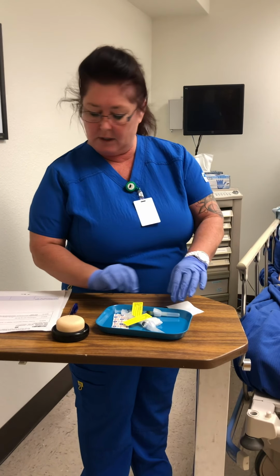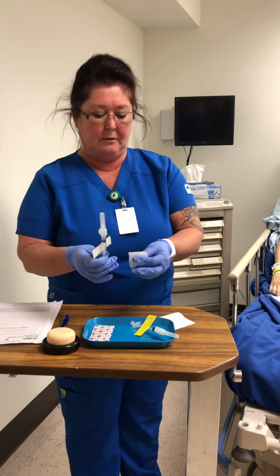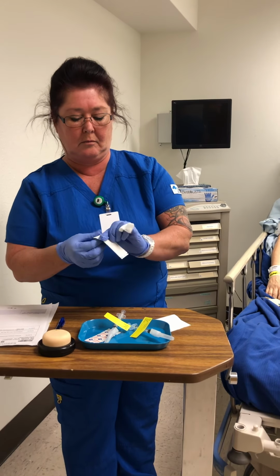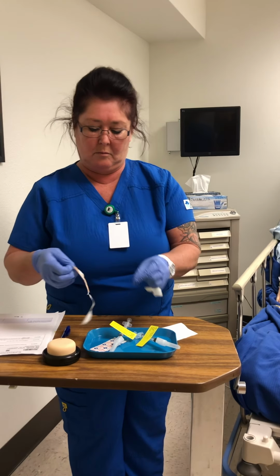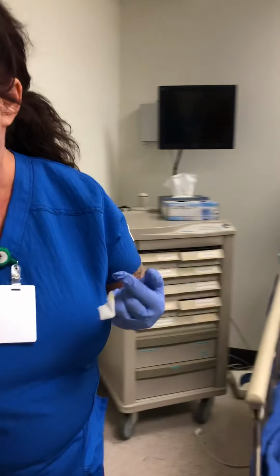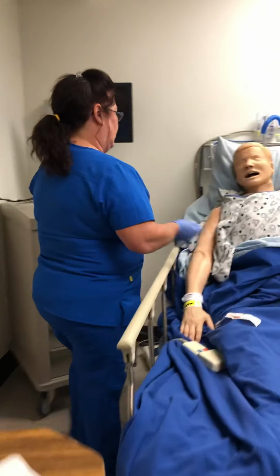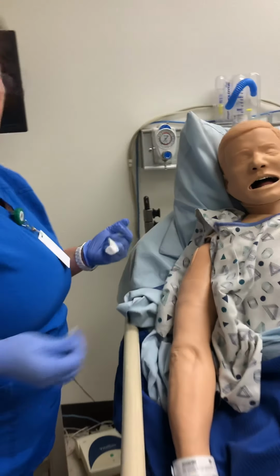So now we're going to do the Phenergan, and we're going to do that intramuscular. So I want to have my gauze, and I want to have a Band-Aid. So we're going to set that right there. I need to get an alcohol wipe. And we are going to wipe the skin from the inside out in circular motion. Again, we're going to let that dry.